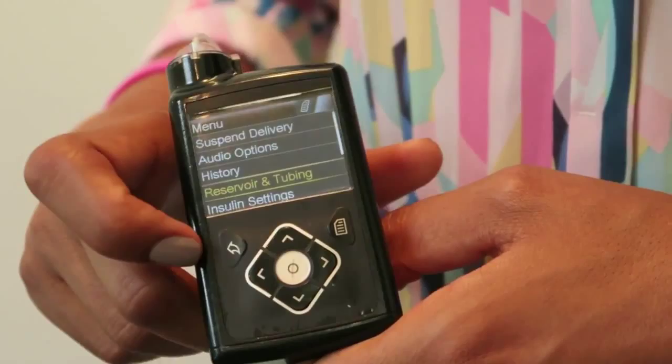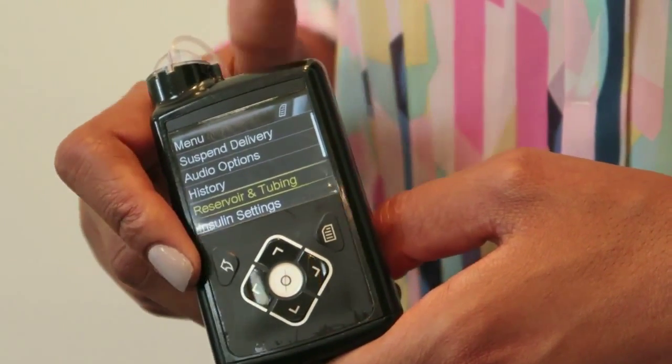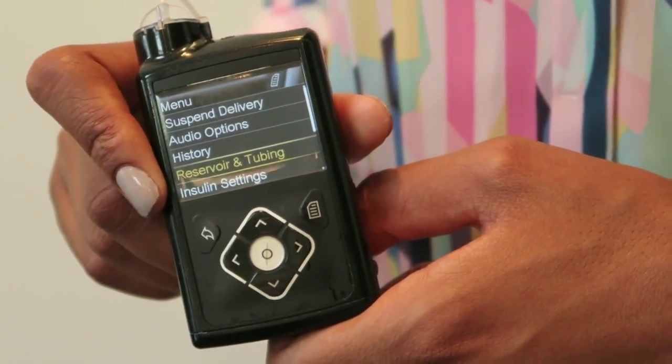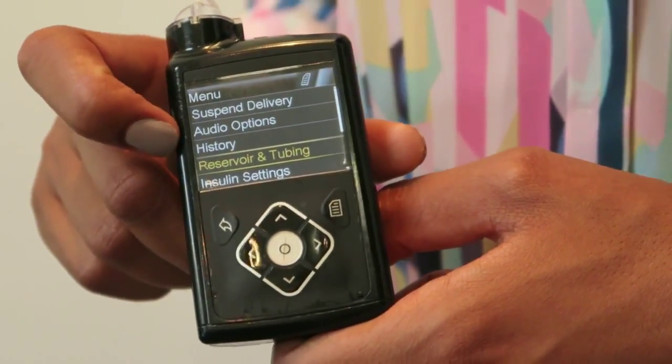We've then got the reservoir and tubing option. The reservoir is the part of the pump up here which holds the insulin that delivers through the tubing. So if you need to change those or top them up because your insulin has run out, that's the option that you need.